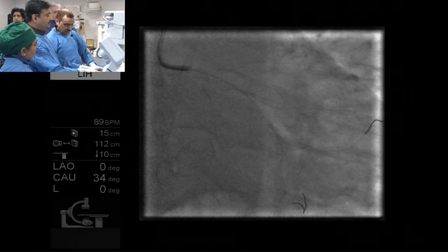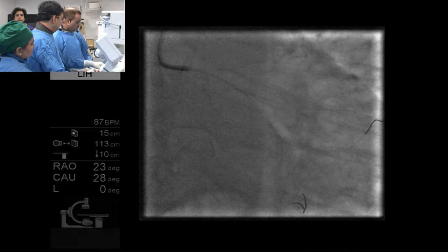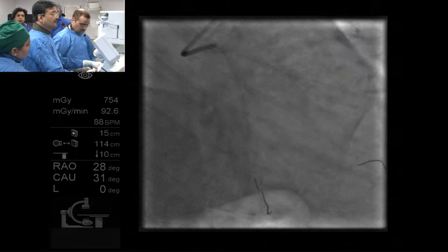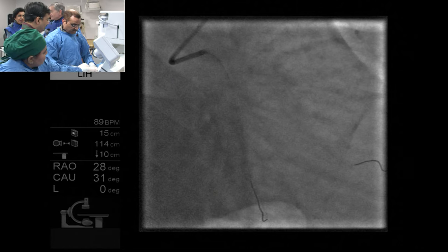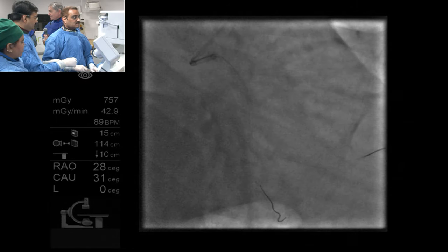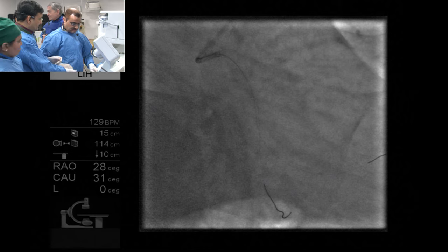Using trapped balloon? No. What I'm saying to you is for the young operators, we mentioned that sometimes for bifurcations, you can use a trap balloon technique, like Dr. Saito taught us, where you put a balloon in the side branch, blow it up at one atmosphere. There's an anchor balloon. So if you have one main branch, you want to cross a side branch, I put the balloon distal to the bifurcation and anchor it to 3 to 4 atmosphere.